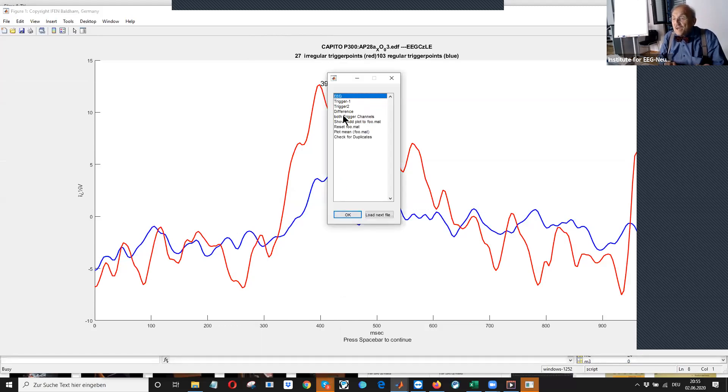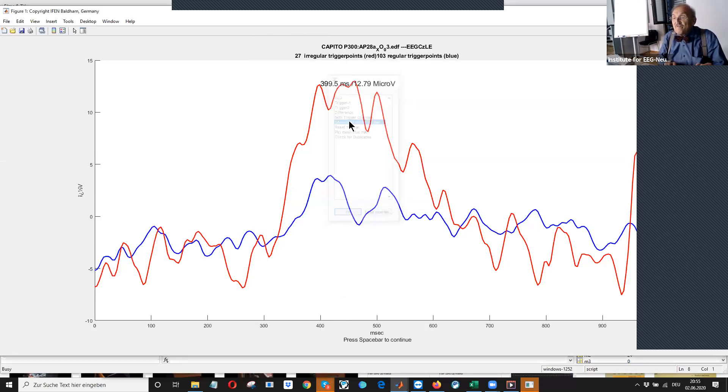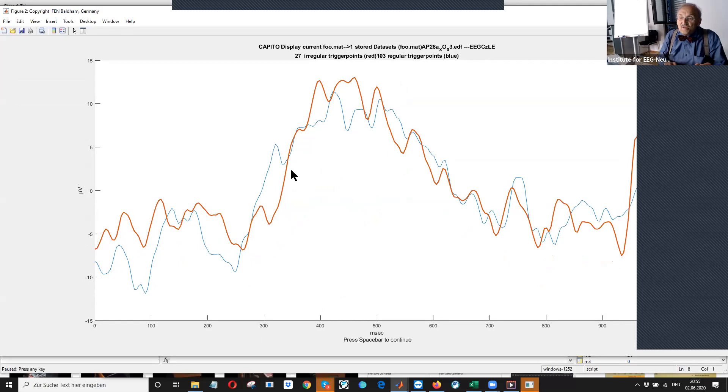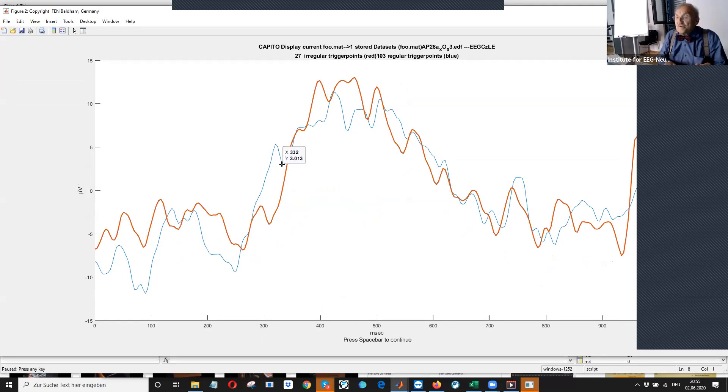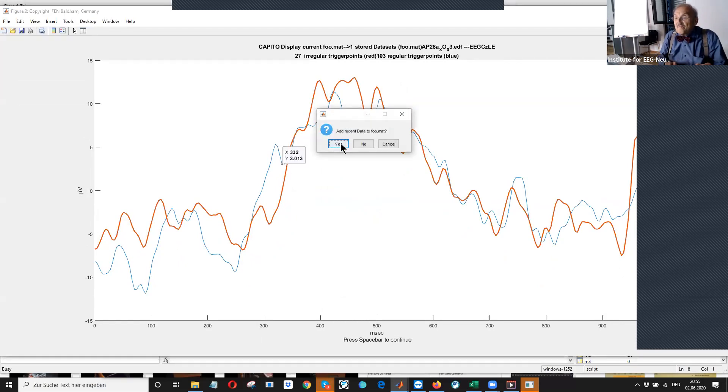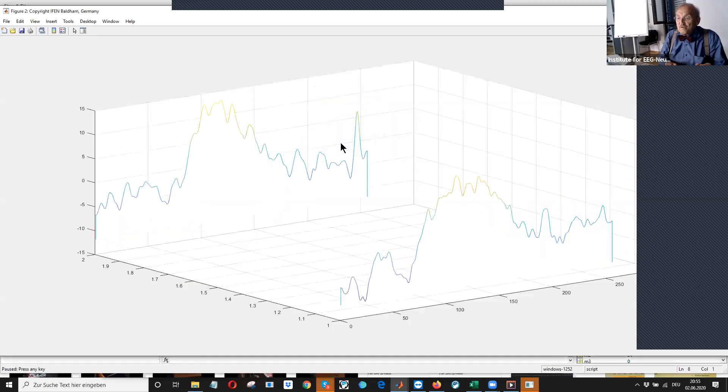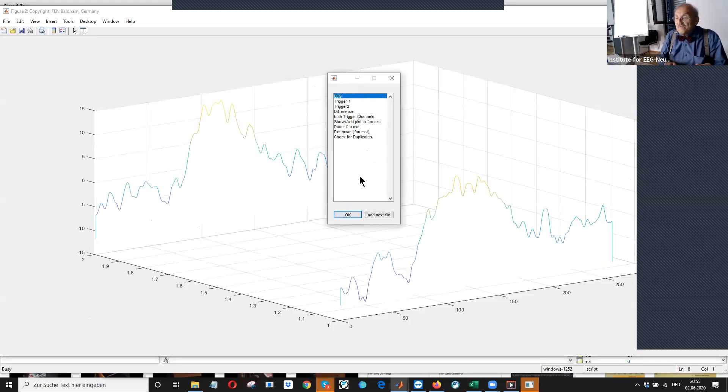Then we add this again to our buffer. Now we see these are the two we have now stored. We say yes. Please edit.